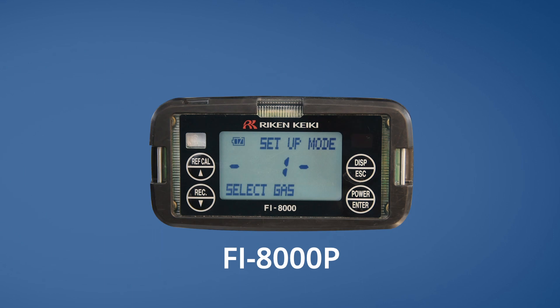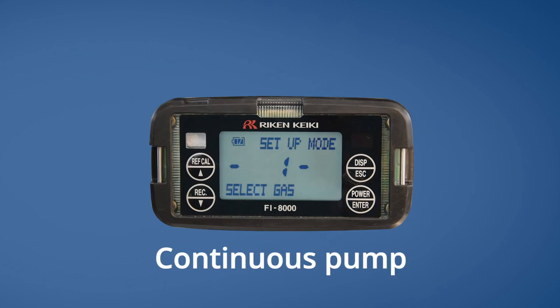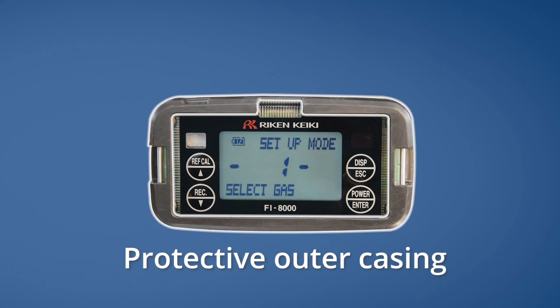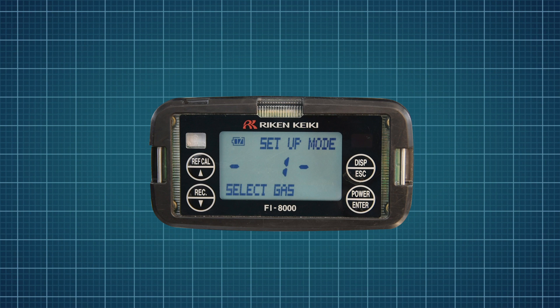The new FI-8000P is a direct replacement for the discontinued Reichen FI-21, with a larger LCD screen, continuous pump, and a pressure and temperature sensor — all contained in a protective outer casing — providing a fast and accurate readout with no conversion factors required. We created this video to help our customers successfully set up their FI-8000P to receive the most accurate reading possible, while also answering many frequently asked questions.